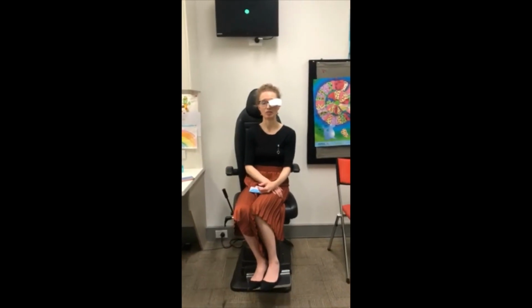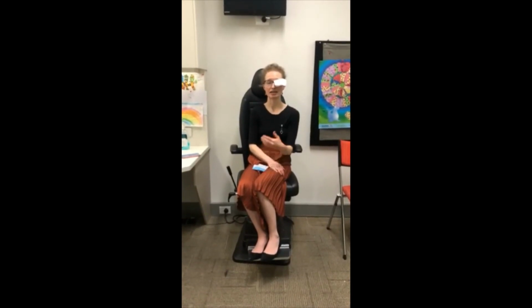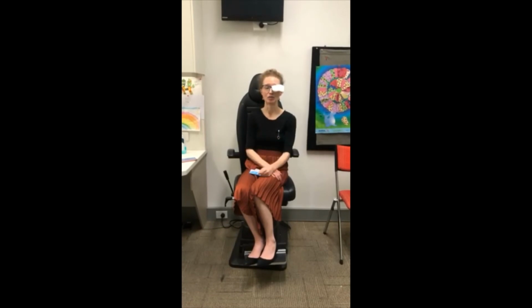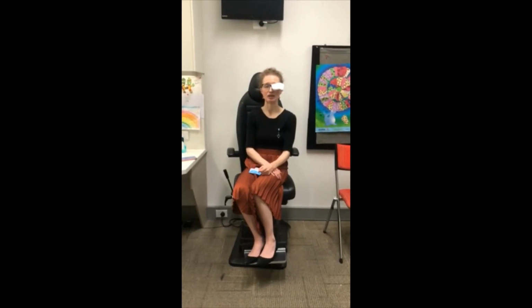Once the eye is fully occluded and you've got the glasses on, you can then start the testing, and you want to move back to 3 meters away from your child, which you could estimate as 3 really big steps, or you could get out the tape measure. Then you can start using your phone with that large letter, asking them to report the letter. In younger children, you could use the K pictures and ask them to report the pictures.